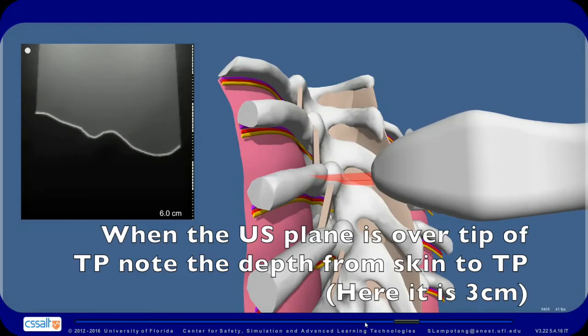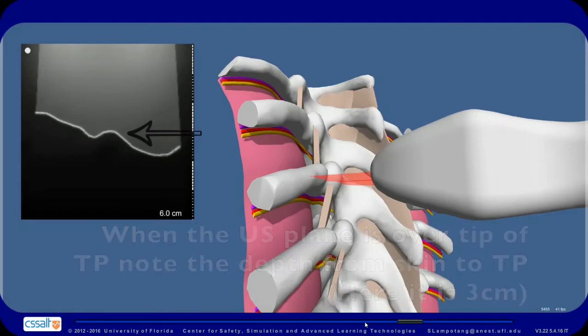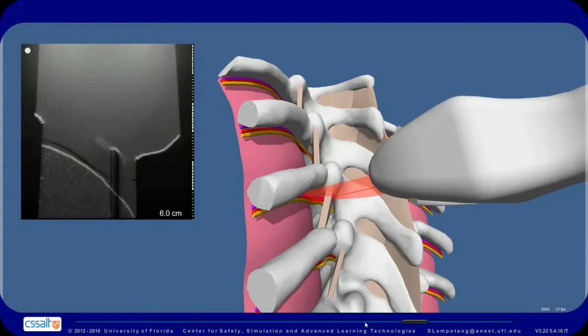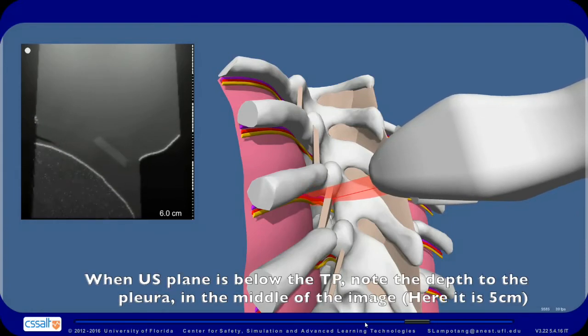When the ultrasound plane is over the tip of the TP, note the depth from the skin to the TP — here it is 3 centimeters. When the ultrasound plane is below the TP, note the depth to the pleura in the middle of the image — here it is 5 centimeters.